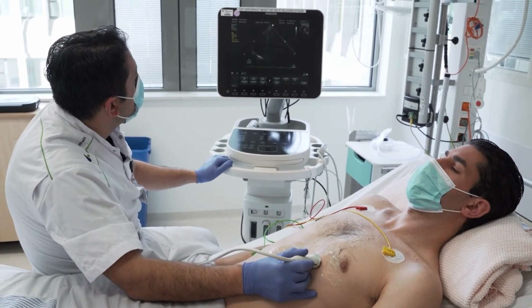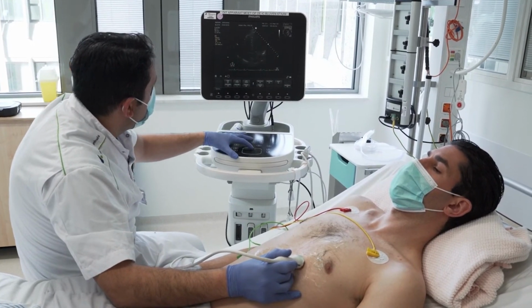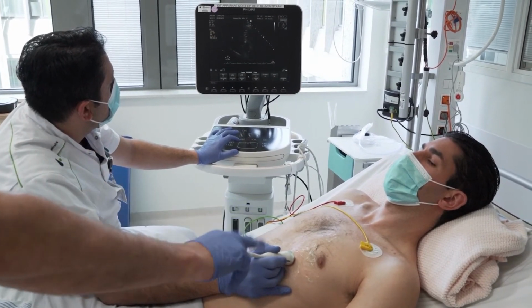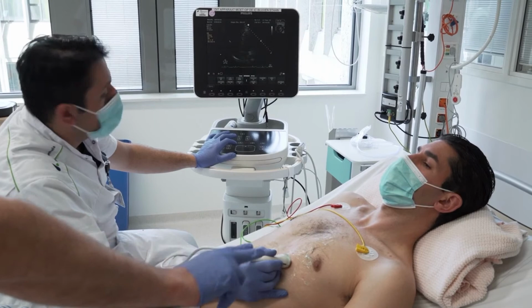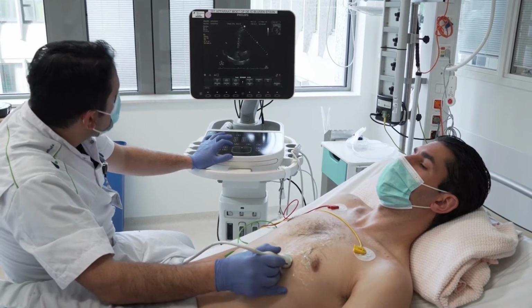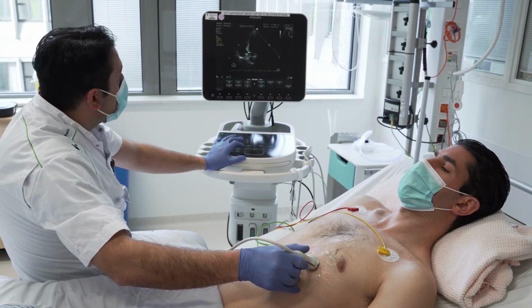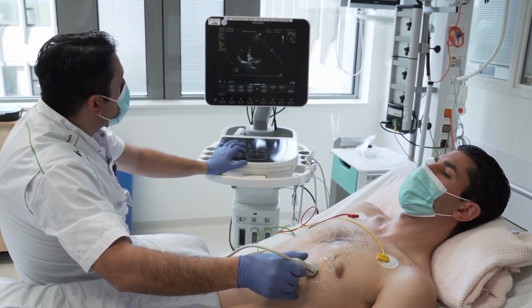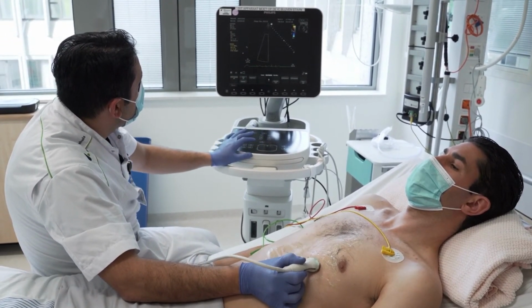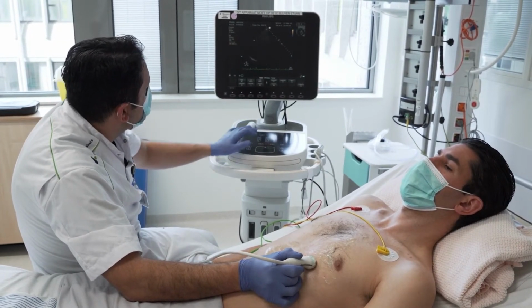Let's see if we can get the 5-chamber view. Yes. So it's just by tilting the probe a little bit like this from 4-chamber to 5-chamber. And you can go back and forth. And if you have serious pathology of the aorta valve or a serious aorta insufficiency with a color Doppler, you can see this pathology in this window.